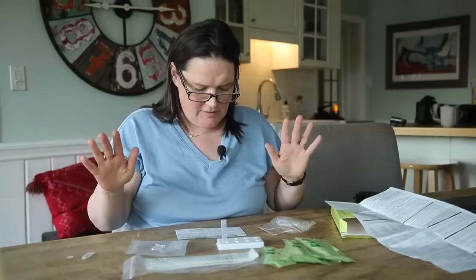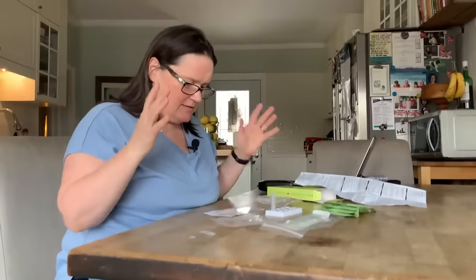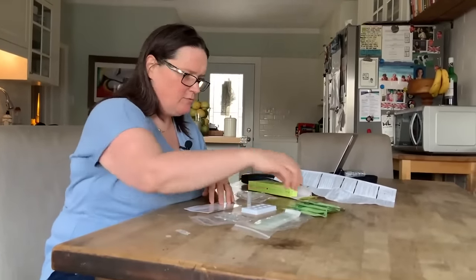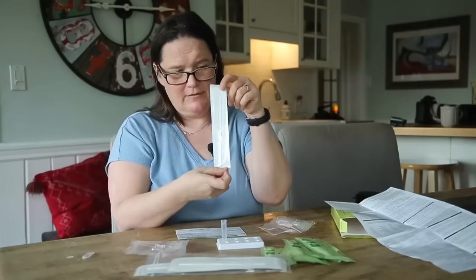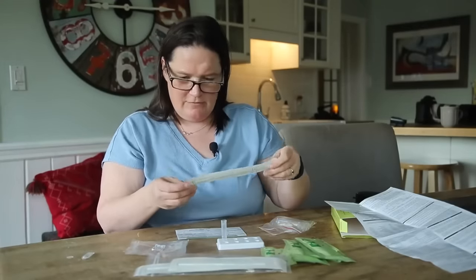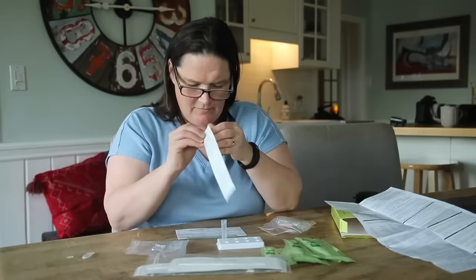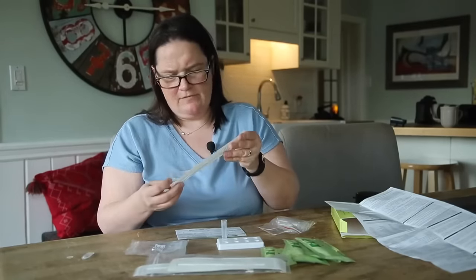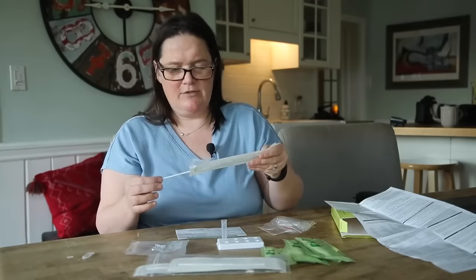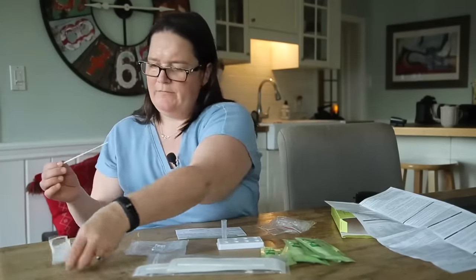Now there are two options: we can either do a nasopharyngeal swab — no thank you — or we can do a nasal swab, which is probably a little bit easier for the kids to do. So remove the swab from its packaging. We've got five swabs here. That's our swab. Lovely. Anyone who's done a COVID test will recognize these. Make sure you get the right end.